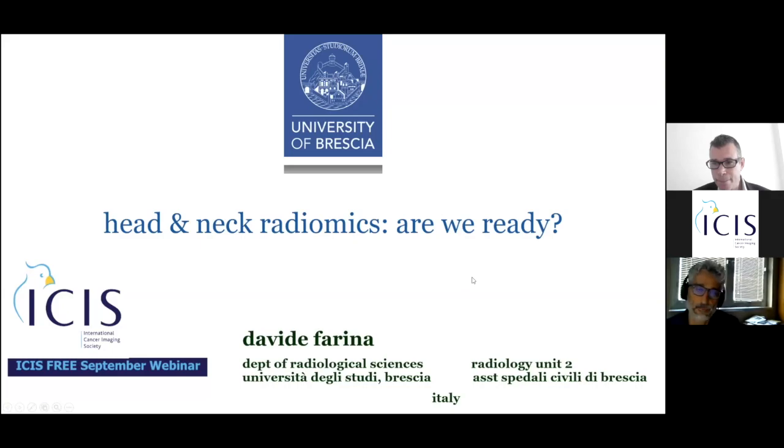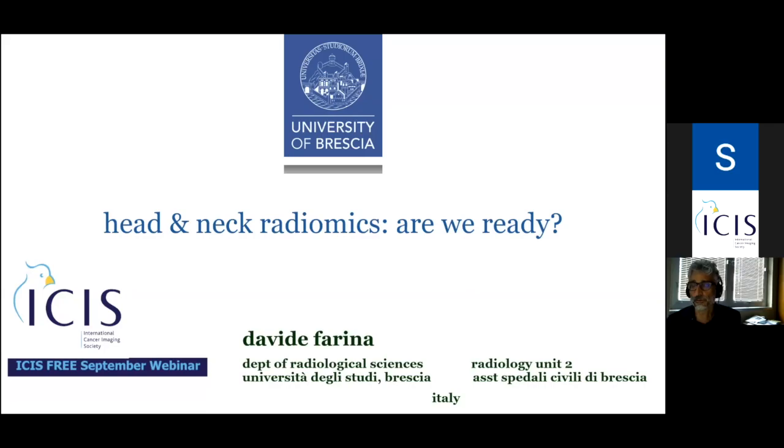So the topic of my presentation is head and neck radiomics. Are we ready? I want to make 2 preliminary statements. The first one is that my presentation will be much more theoretical and less practical than the good one you had from Steve a few minutes ago. And why this? Because DWI is a routine in our work. Radiomics is coming, could be a routine in the near future, but it's far from being clinical at the moment.